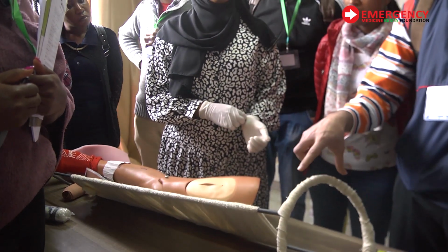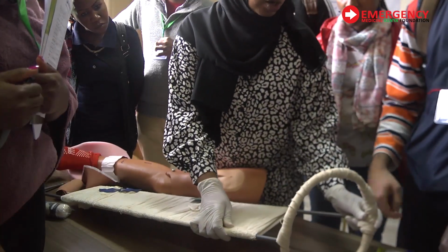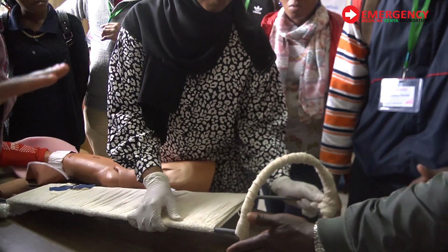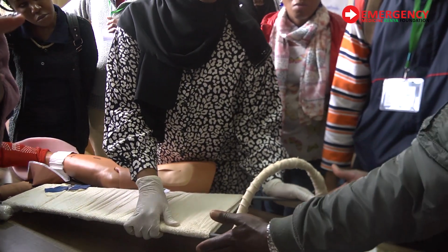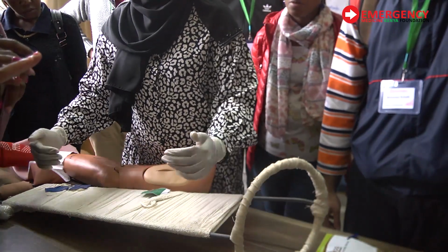No question, but where is this sitting? This here, the gluteal fold. The gluteus is here. So below the gluteal fold, it's where it sits, not above it. Lateral, below it. The shorter surface is always the inner part.